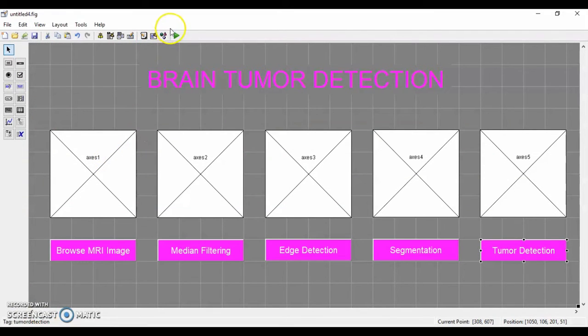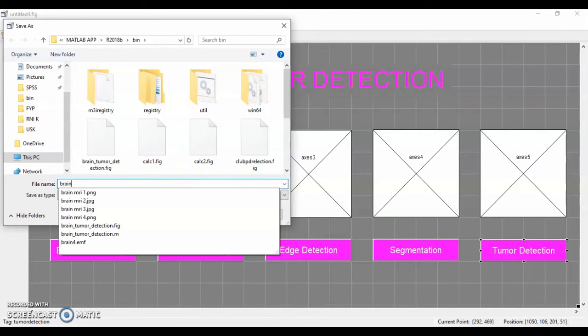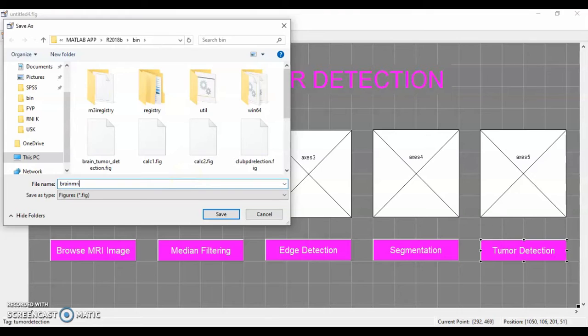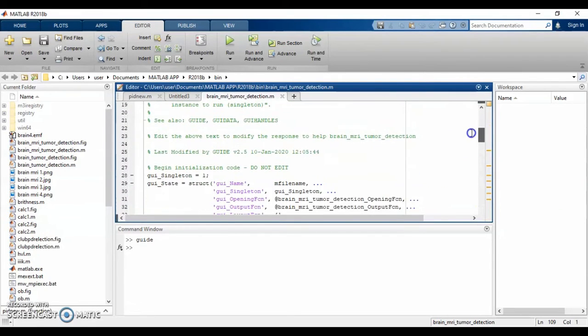So after finish creating the program, we will then need to save the program into the document file. So in this case, we will name our program as brain MRI tumor detection. So after saving the program, the script will then pop up in MATLAB program.